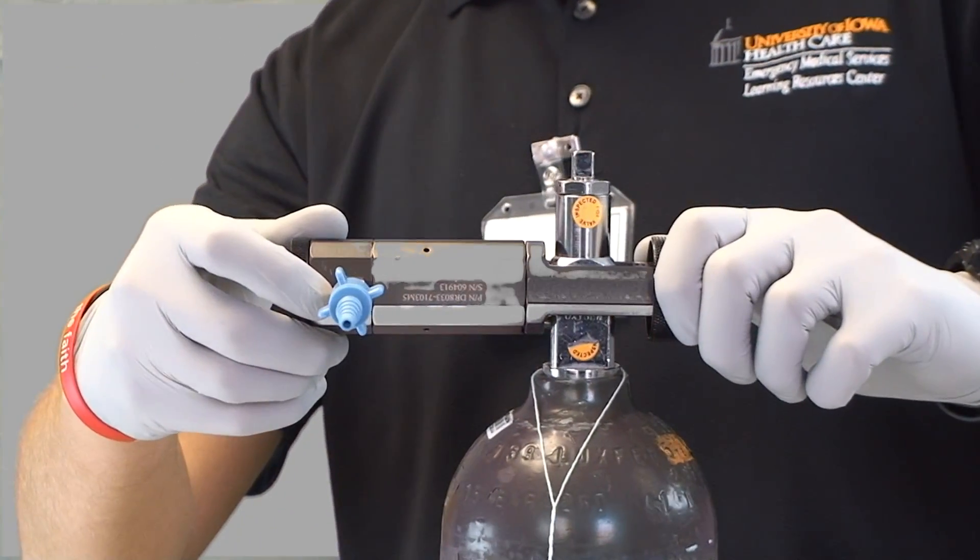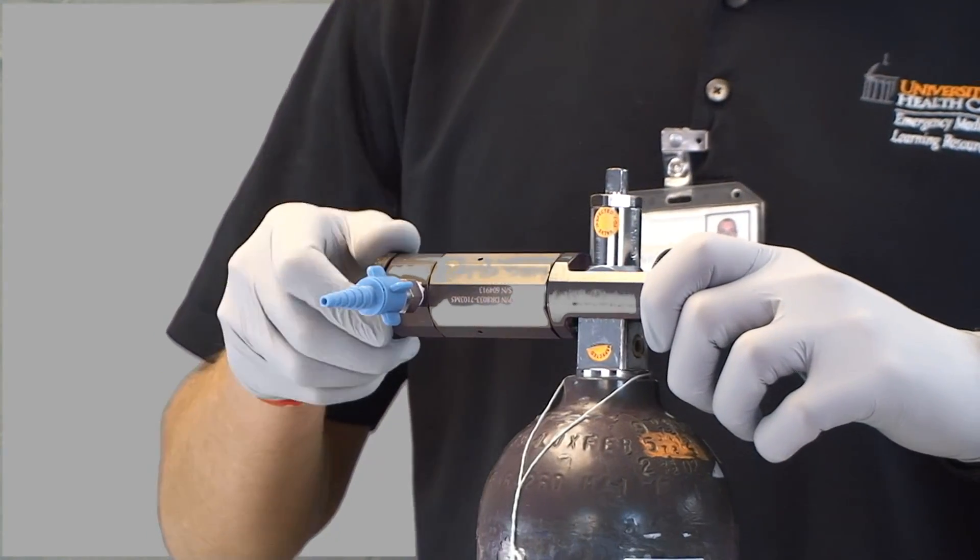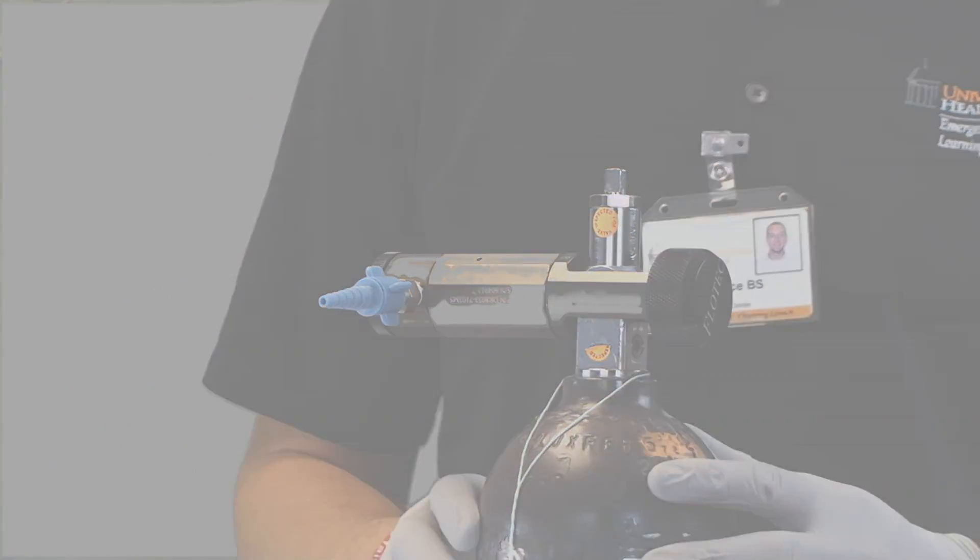Now that I have assembled the oxygen tank and regulator, ensured adequate pressure, and checked for leaks, I can apply the oxygen delivery device.